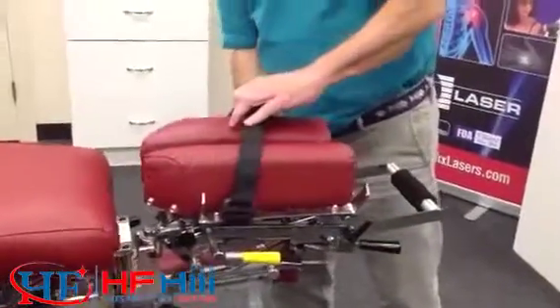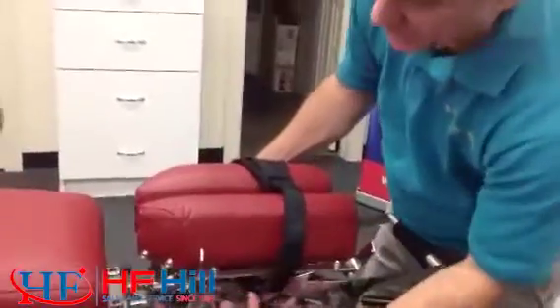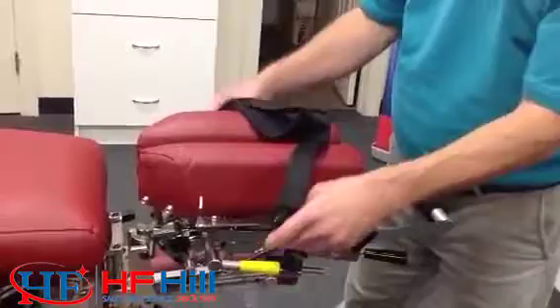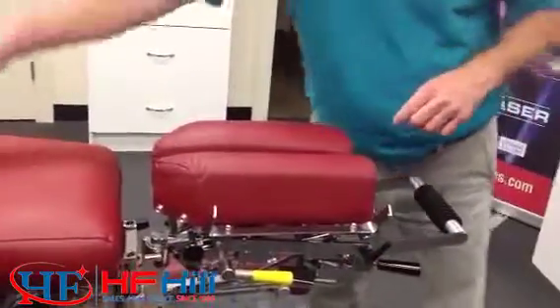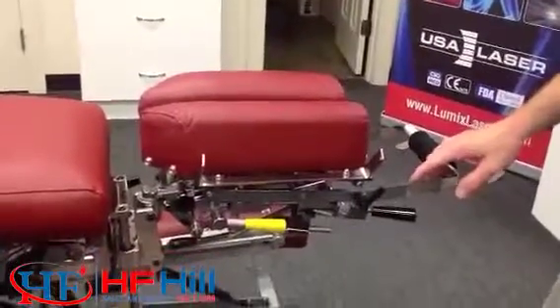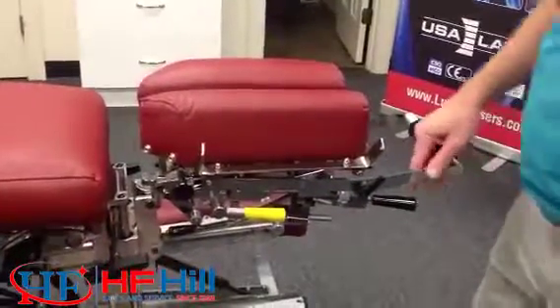It actually snaps on either side. The snaps are just under the piece, so it snaps on and snaps off very easily. So again, we're going to take that off for the sake of this video so that you can see the parts and the components as well as possible.